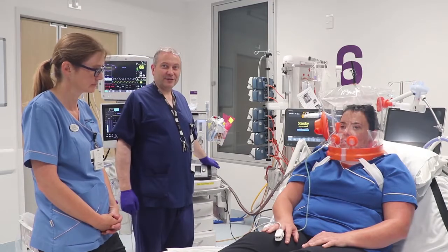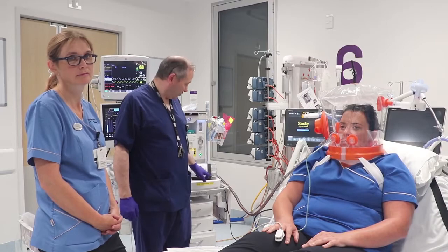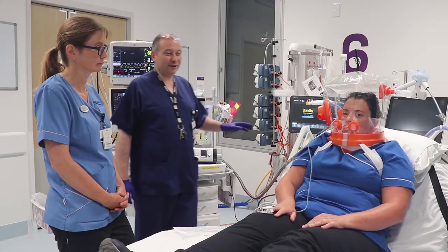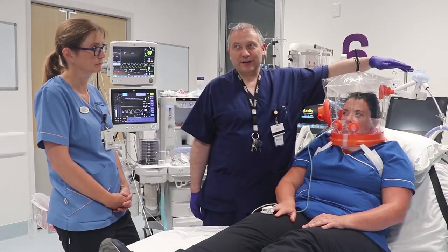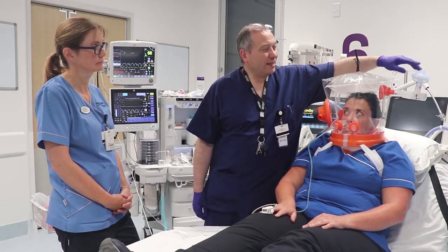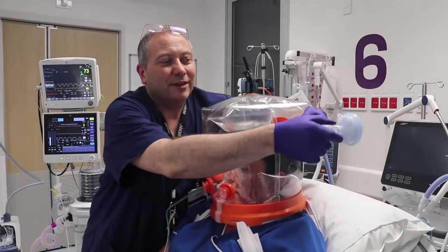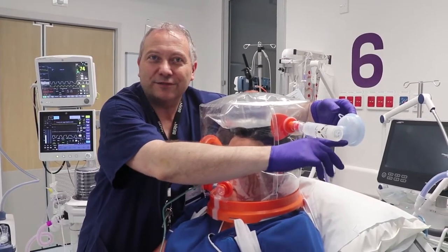In the ResMed Lumis, humidification comes from a water reservoir which should be regularly monitored to ensure the water level stays between the minimum and maximum marks. It's also very important to remember that if there is a viral filter on the expiratory port, water can condense in the filter. Pay close attention that the filter is not wetting out. Keeping the filter at an angle allows you to see the fluid level developing, making condensation more apparent than in a vertical orientation.